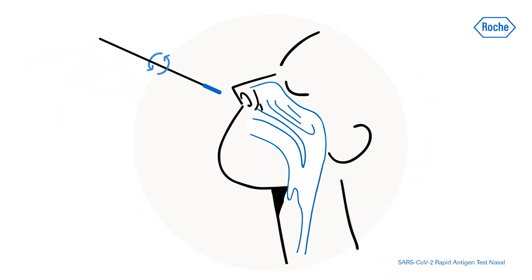Rotate the swab while inserting it two centimeters, slightly less than one inch, into the nostril and parallel to the palate until resistance is met at the turbinates.